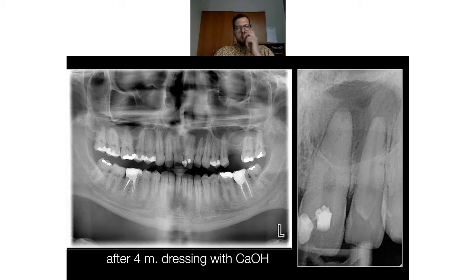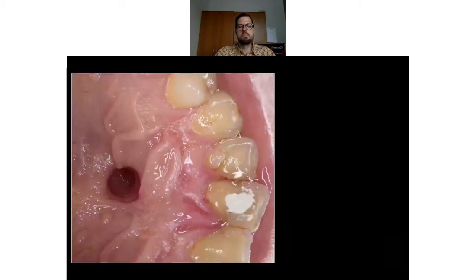So I spoke with my surgeon, and he told me, okay, make such a window in the place where the resorption of the bone is. So you take your electric device, make such a window, and I excochleated all the space, and there were still some pus flakes in the hole.